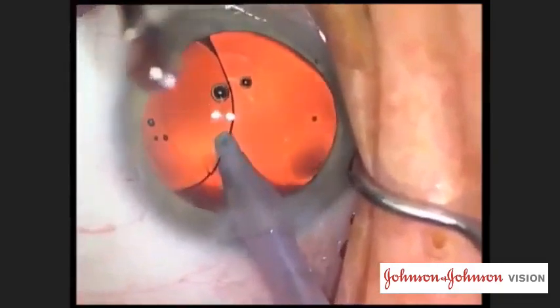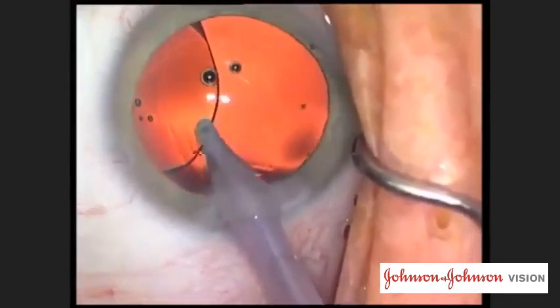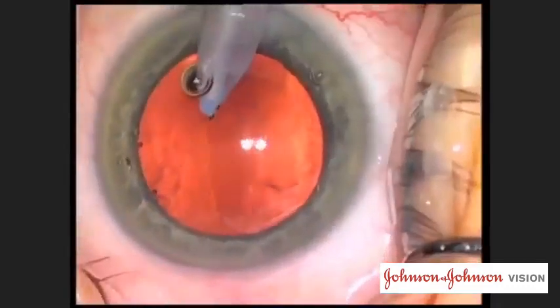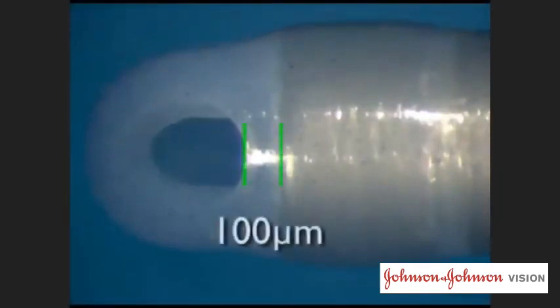Despite proper care, we were still getting PCRs when using these new tips. The tips from these cases were saved for examination. The tip that caused a PCR during capsular polishing showed a normal, intact silicone sleeve, but the distance between the aspiration port and the underlying metal tube was only 100 microns.